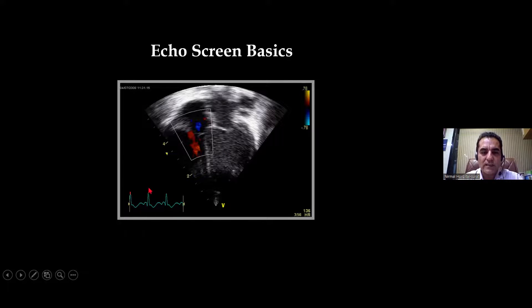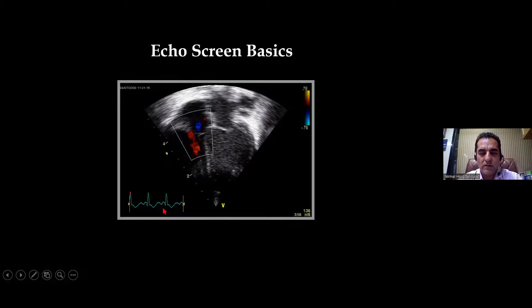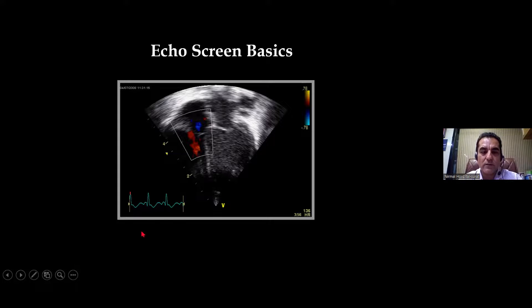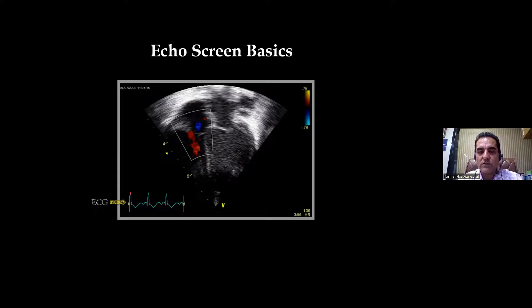What you're seeing here is an ECG. Ideally, all echo studies should be done with the ECG on. Normally for clinical purposes we don't do it, but for research purposes we ideally should. So these are the few basic things we see on our echo screen.